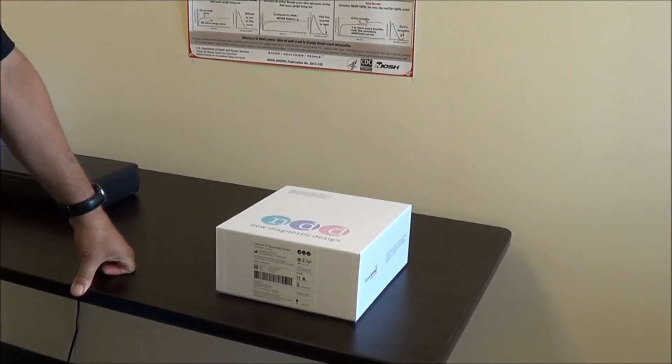This video is going to show you the initial setup and configuration of the EZ-1 air spirometer.